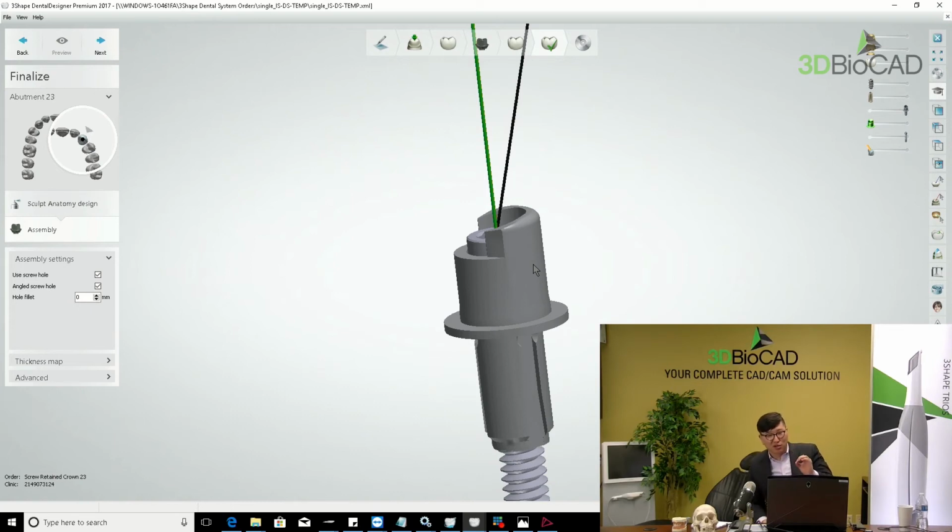So after surgery, the doctor puts the titanium base in the patient's mouth, then puts the crown in, and if it needs a little relining, or just cementing, cements it in the patient's mouth. This way, of course, cannot be 100% correct, not a non-touch-anything way. But at least the doctor can save a lot of time chair side, making and putting the resin in and drilling themselves. The doctor can save time.